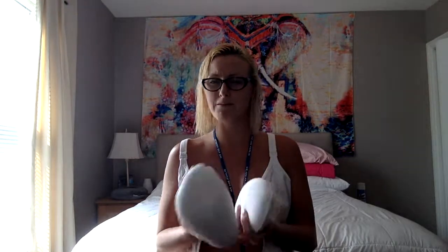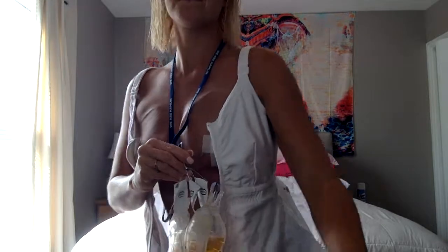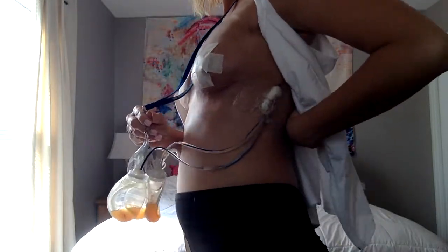Okay, so actually this vest, what I'm going to do is I'm going to show you first how I shower with the lanyard and what my drains look like 20 days post mastectomy as well, because they're still in. And so, okay, now with the vest also came these nice little cushions here. I never used them. I'm thinking that there's a space here maybe to put an ice pack. I probably never iced them down. Pain meds did their job. Okay, so here are my drains. They are attached here to, this is my left side.